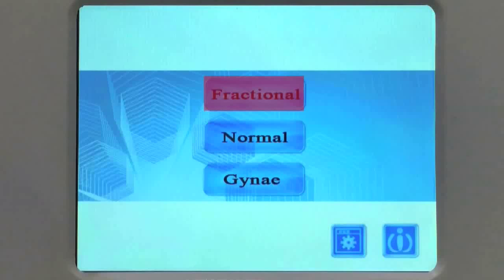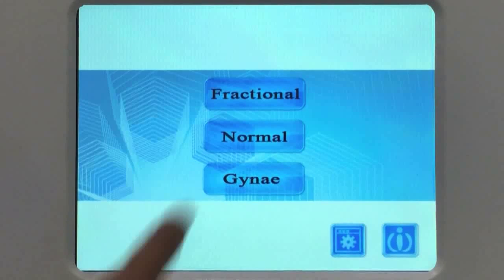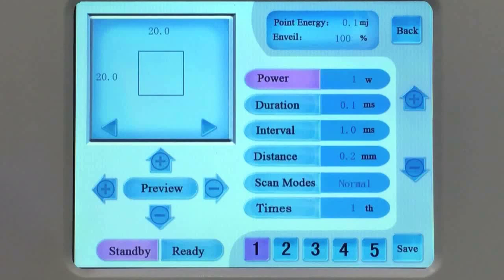Firstly, the fractional mode. Adjust parameters: power adjust range from 1 to 40 watts; duration adjust range from 0.1 to 10 milliseconds; interval adjust range from 1 to 5,000 milliseconds; distance adjust range from 0.1 to 2.6 millimeters.